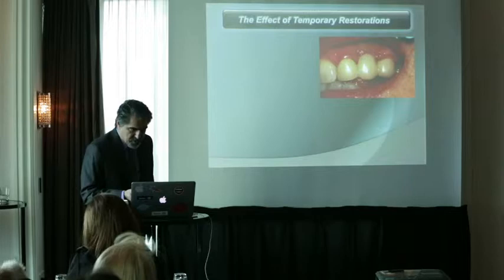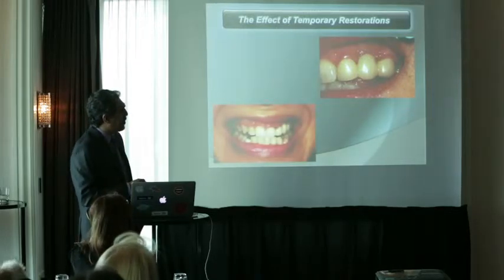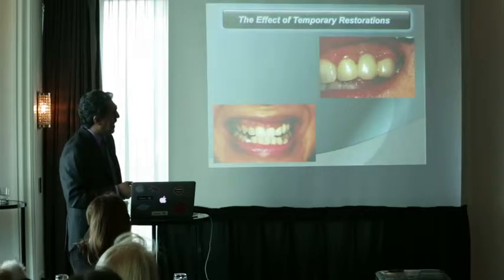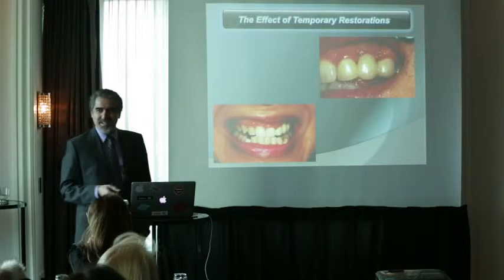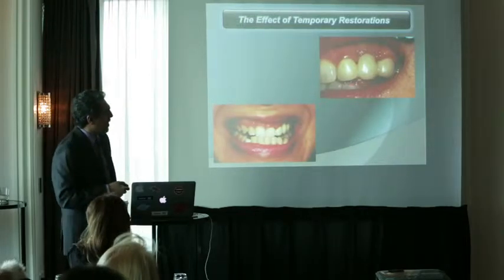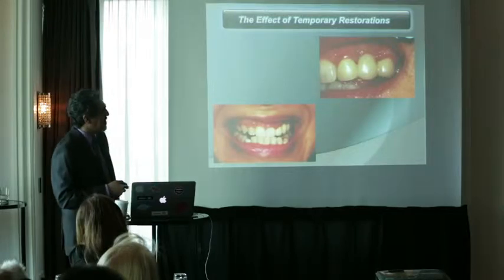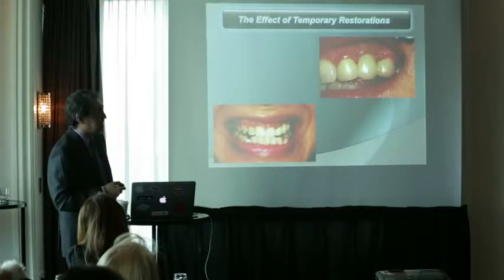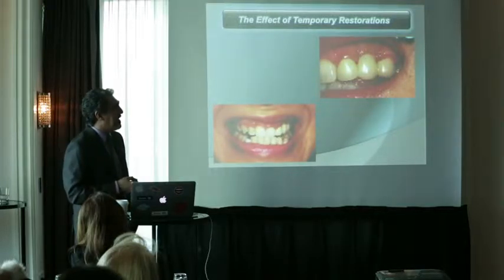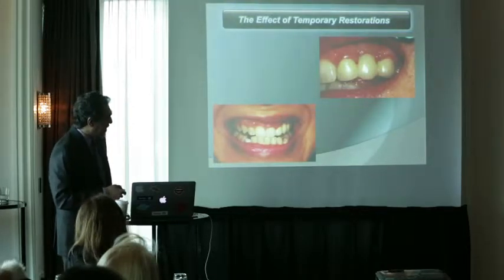Unfortunately, the first picture doesn't show, I don't know why. But the problem was that this one, Hamid probably knows this case better because I have done that in a practice. He is involved too. This tooth is a prep, and this is replaced by an implant. So the implant is healing at this point, and the patient. So I put the temporary.